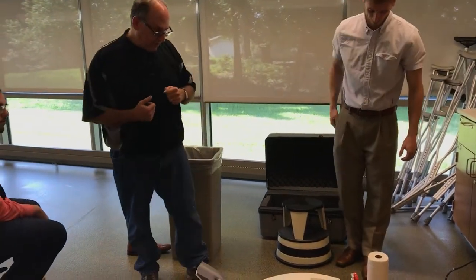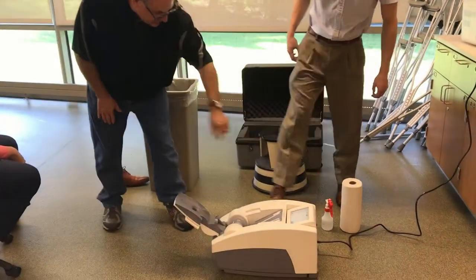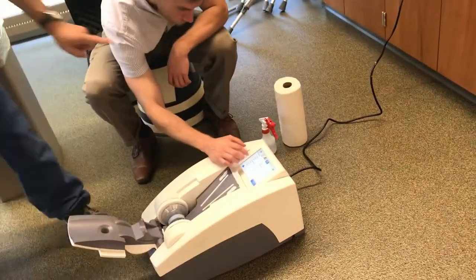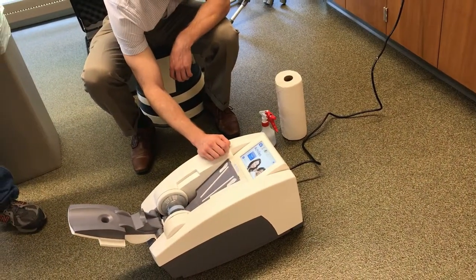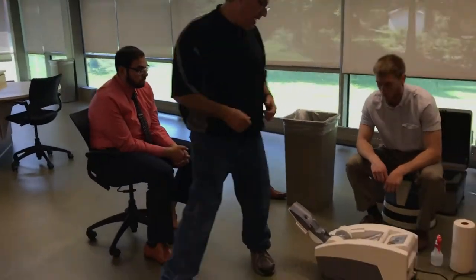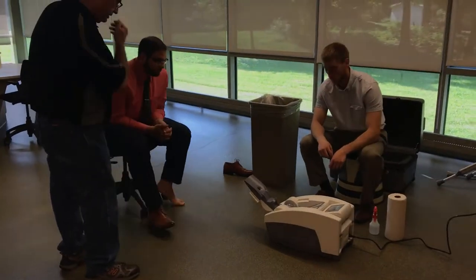We're done and ready to go. Have a seat and hit the little home button on the top left corner. Now instead of QA, it says measure — and it's ready to do our first patient. We'll have our patient come on and roll on up.